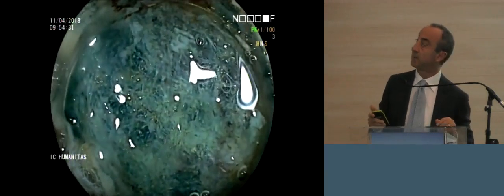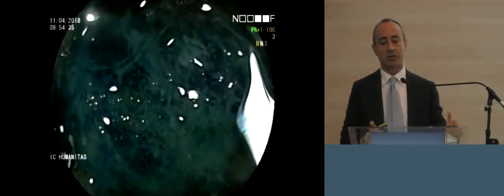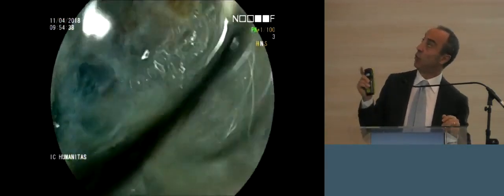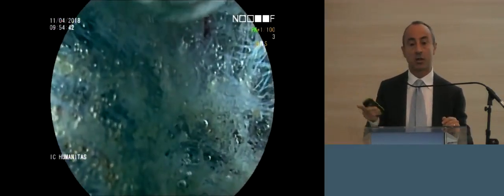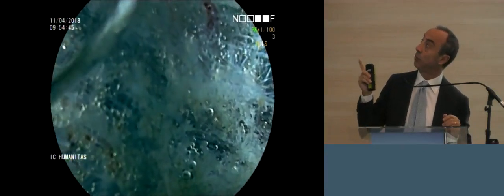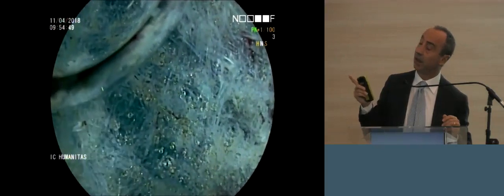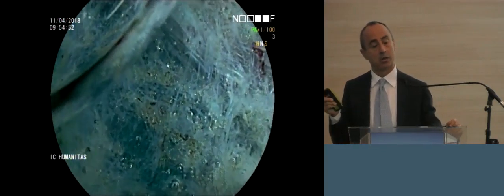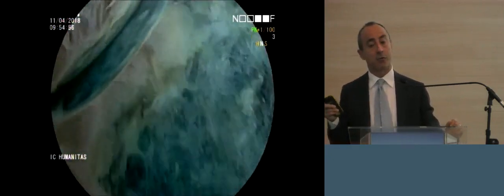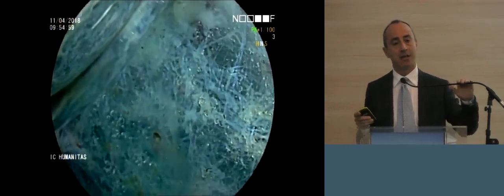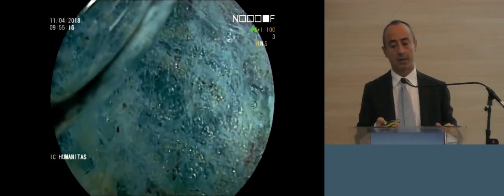Now look — we are about seven minutes later. We are looking at the base of resection using optical zoom. We cannot appreciate the muscular layer, which means there is a lot of submucosal solution remaining. You can see the little bubbles — there is still a lot of submucosal agent injected there, staying for a very long time. This is very nice because it's helpful in preventing the risk of delayed perforation.